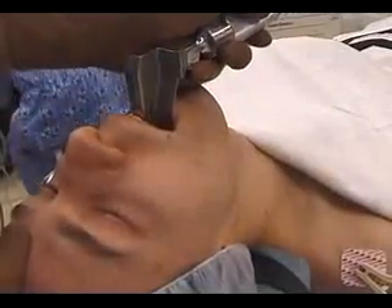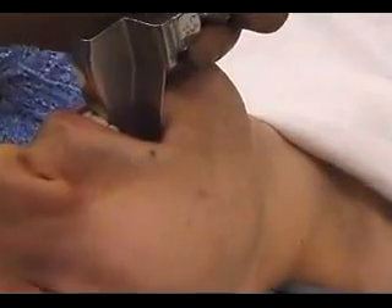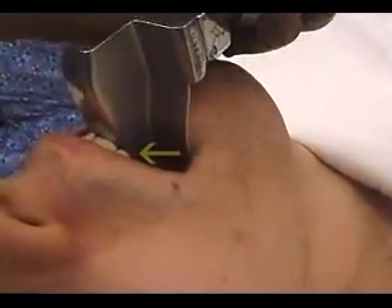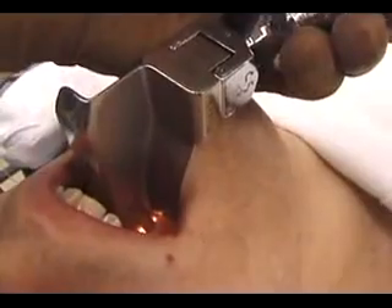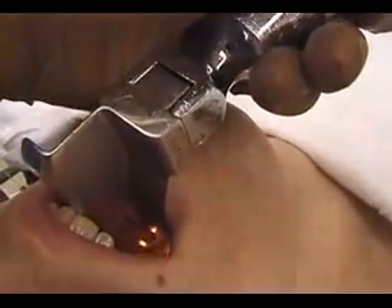A frequent problem is using the upper incisors as a fulcrum. Dental injury is a common cause of medical legal litigation. Dental complications can be minimized by always being mindful of not applying pressure to the upper teeth.